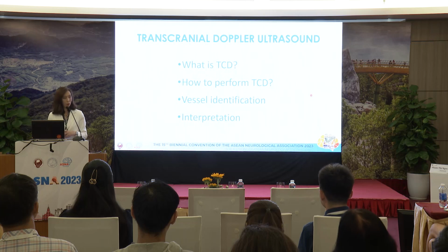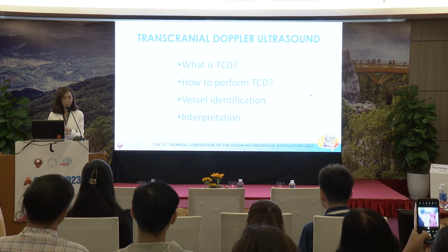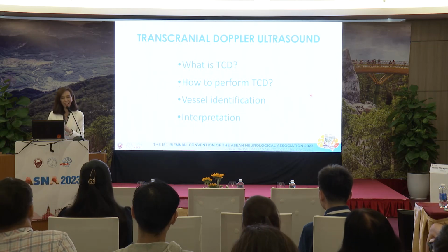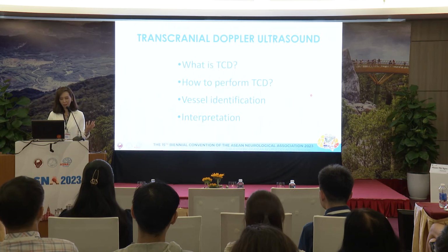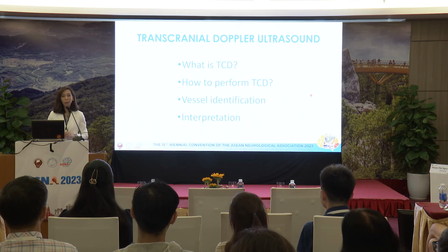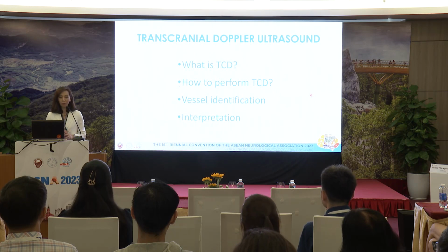Transcranial Doppler, or TCD, is actually coming back in time a little bit. Dr. Romani talked about TCCD, which is a newer version of TCD. In the old days, we were very used to this blind TCD. It's very convenient. You can carry it around. The machine is quite small.